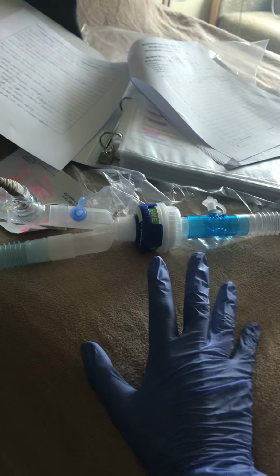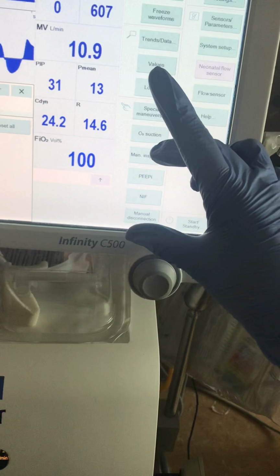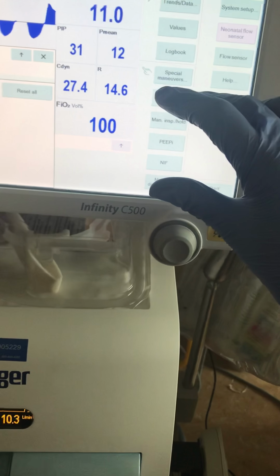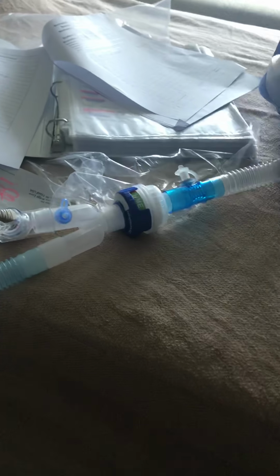Let's say the patient has a home medication of Symbicort. We can deliver that in line as well. So this is our MDI. We can take this tab off, the little canister, and put that in line. Then we want to deliver the medication and a breath hold at the same time, so we kind of want to time it well. We're going to disperse and then give a breath hold and release. We're going to wait 30 seconds, disperse a breath, and hold. You just want to do that simultaneously. So those are suctioning, MDI, and aerosol.